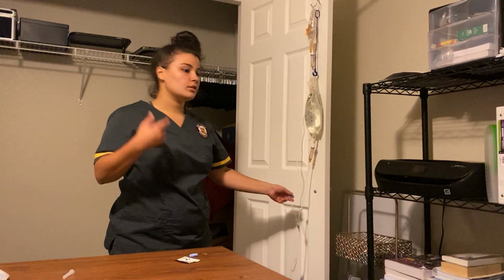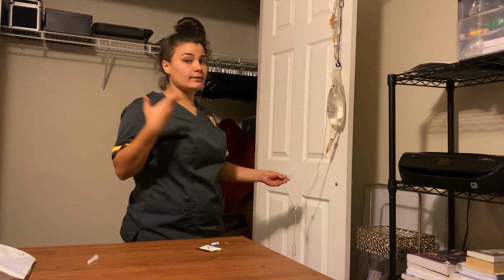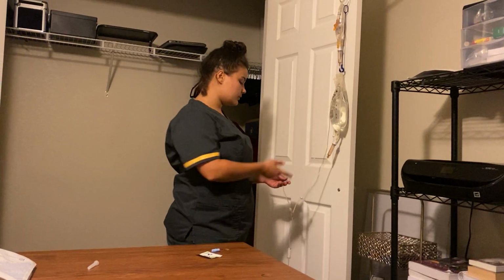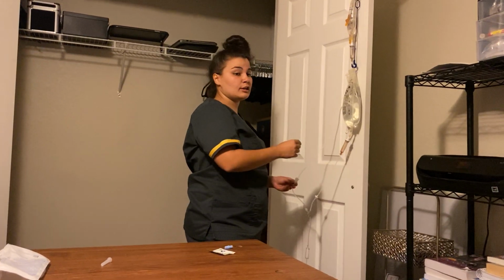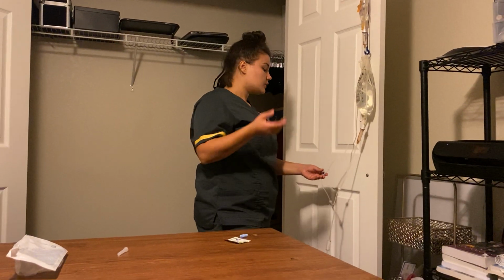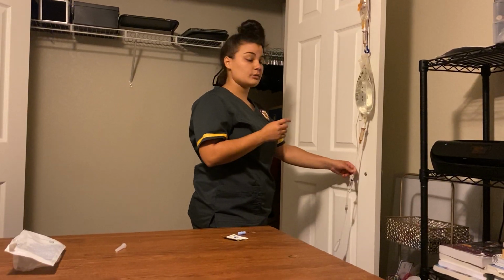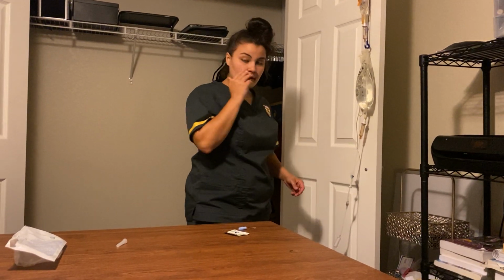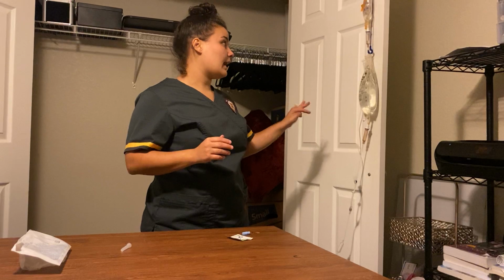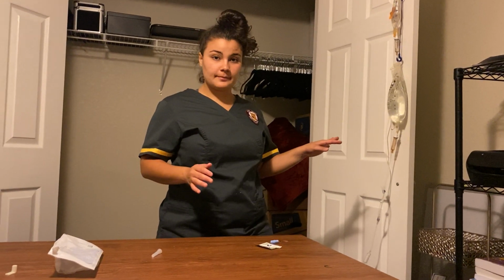Now I have to do my drops per minute. I have to set the infusion rate. So I'm going to do my drops per minute for 21, like we calculated from the medication. I'm going to set it for 21 drops per minute. Now, whenever I've finished setting my rate and everything, I'm done doing that.